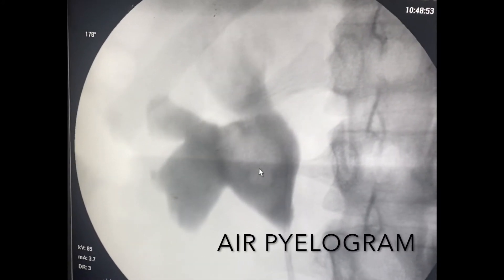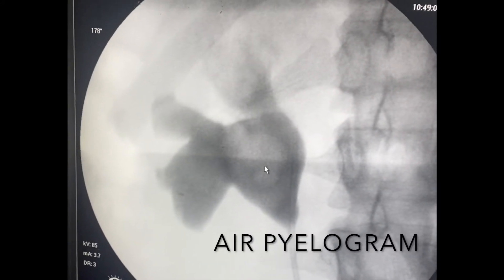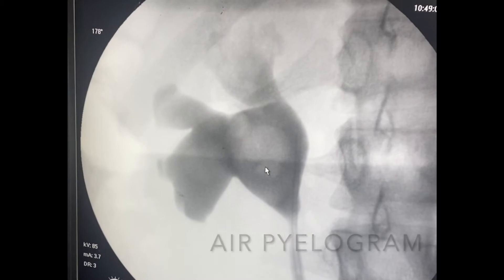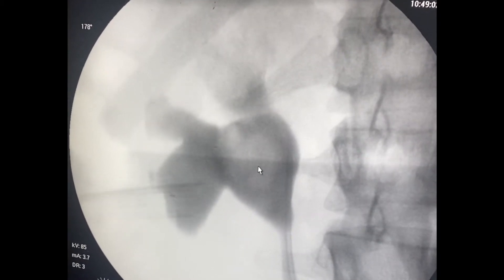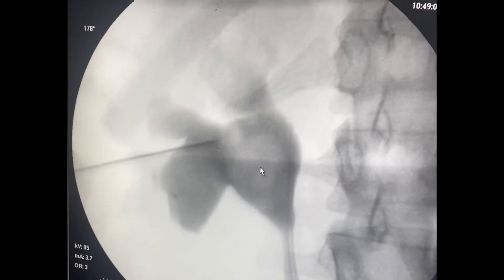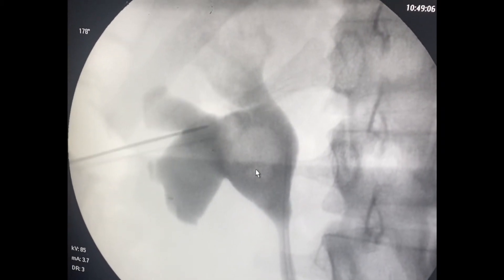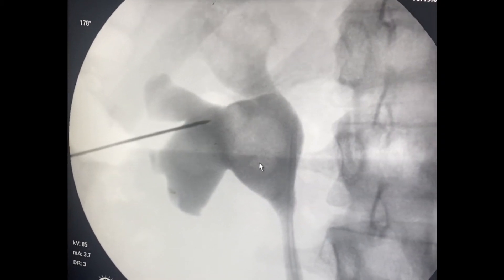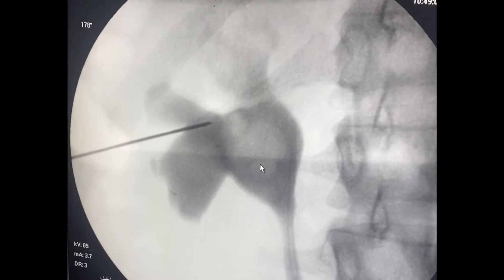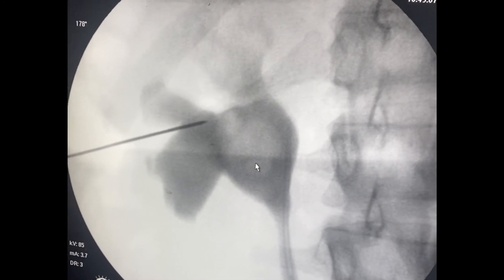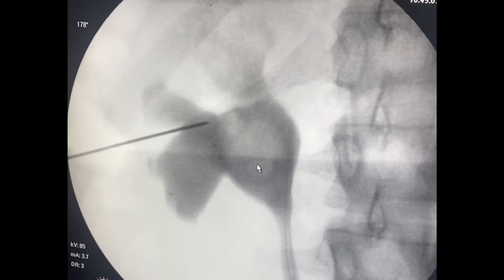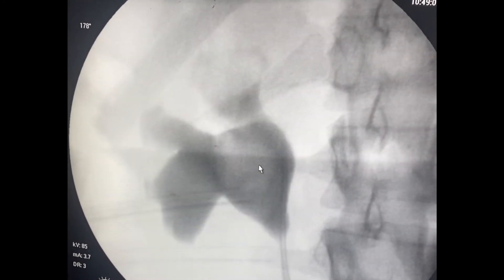To identify the mid posterior calyx, an air pyelogram was performed. After injecting air, as pointed out by the needle, a faint white area is seen medially, overlying close to the pelvis.